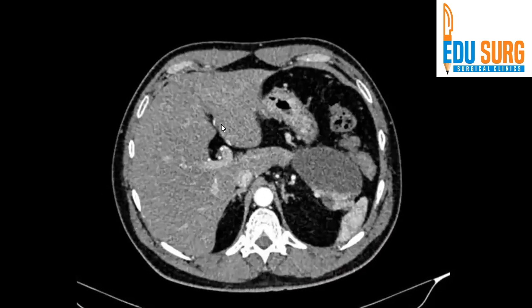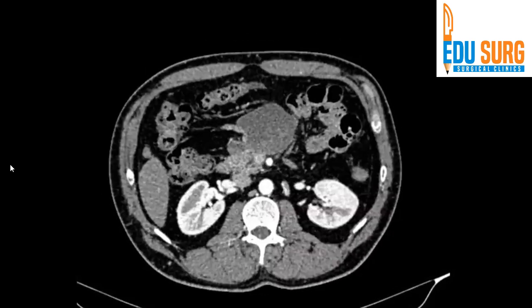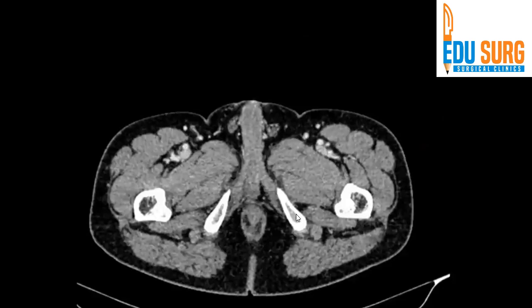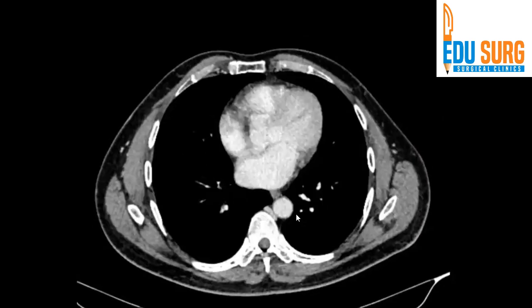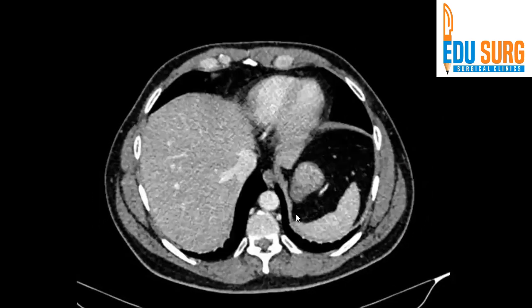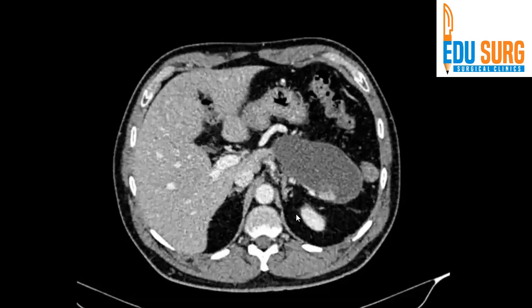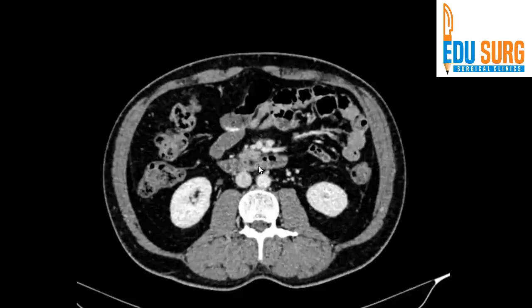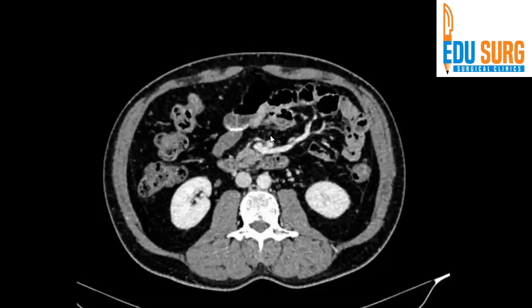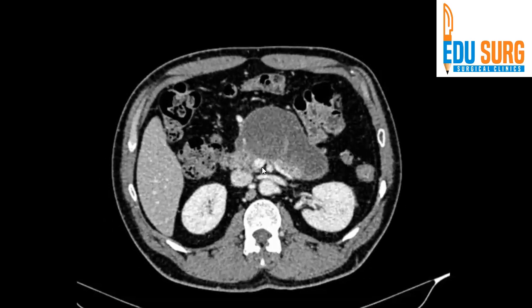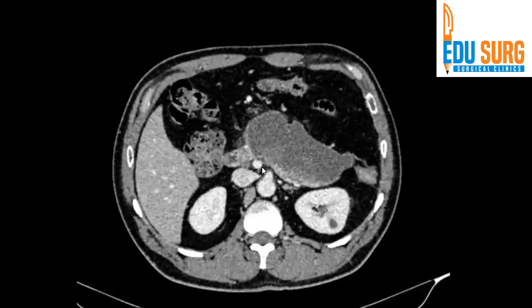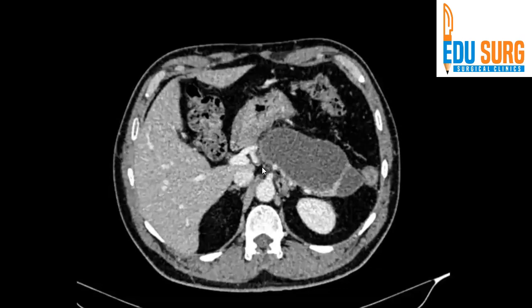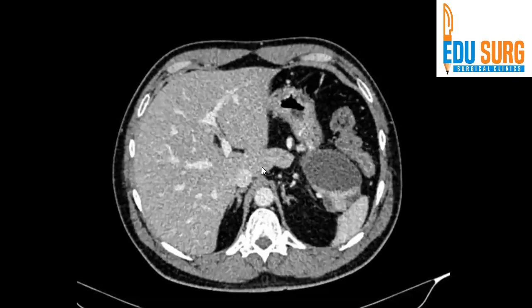So there are two separate collections — that is something you should know. Moving to the next interesting point: this is the portal venous phase. You can see the portal vein and the superior mesenteric vein. That is the superior mesenteric vein and that is the portal vein.